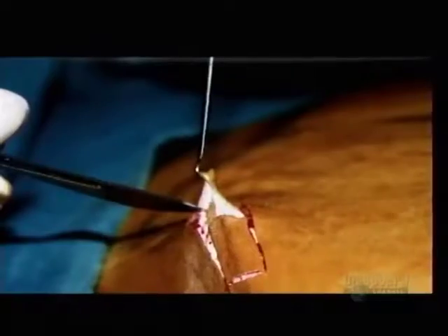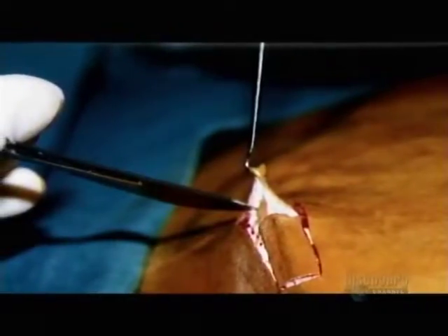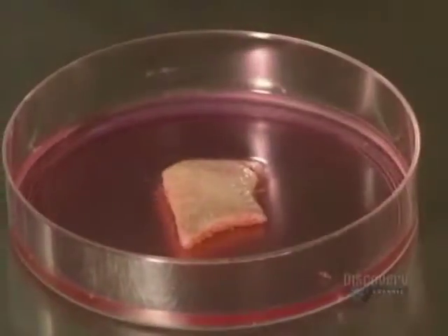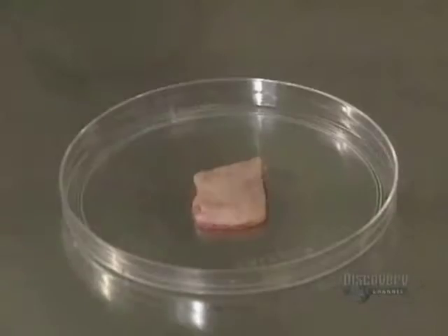To grow skin, epidermis cells have to be isolated and made to multiply. It all begins with the removal of a small skin sample. The 10 million cells in this piece are enough to make a culture. The skin soaks in a medium containing penicillin and gentamicin, antibiotics which protect it from bacterial infection.